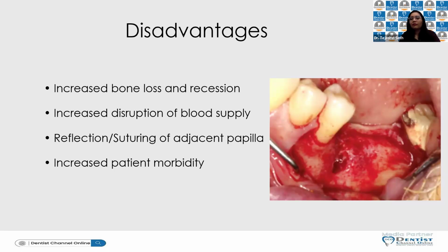You don't want tissue hypoxia. And if you are reflecting your flap or doing any procedures and you can see the edges of your tissues turning a bit white, a bit pale, then you need constant irrigation. Again, your normal saline works.